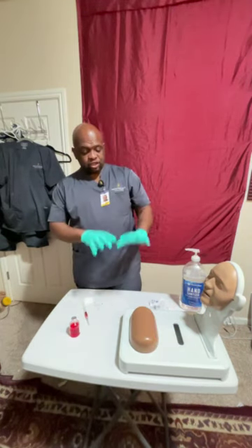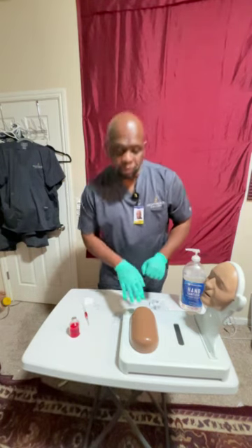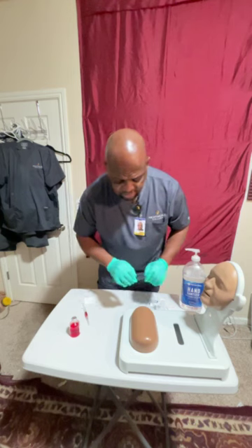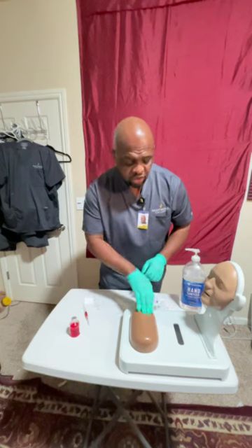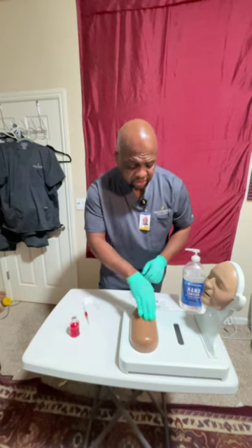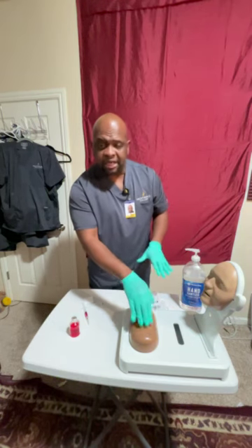But now that I've determined where the injection is going to be, what I'm going to do is inspect that area. I'm going to first look at it, looking for any type of lesions, any discoloration, redness. I'm also going to palpate the area. I'm going to feel that area, making sure there's nothing wrong there, no swellings, no bumps, anything unusual. Everything looks good on the patient's skin. The patient had voiced that he doesn't feel any pain there.